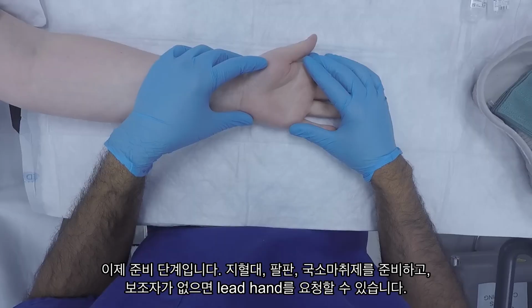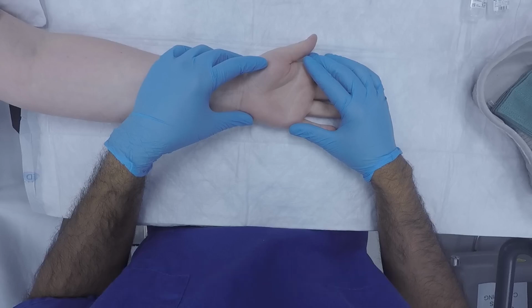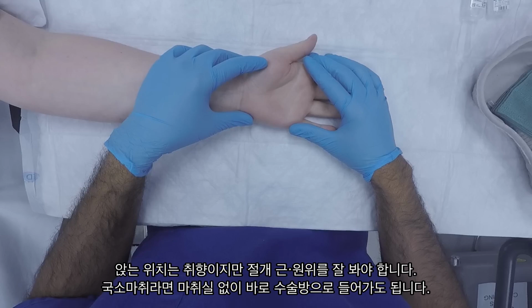Where you sit is another personal preference thing. You can sit in the axilla, on the outside, or even at the end of the arm board. There will be a bit of leaning either way to make sure you can see down the incision proximally and distally to make sure the ligament has been released, but again, where you sit is up to you. Here, we're going to sit in the axilla for doing both the left and the right side.